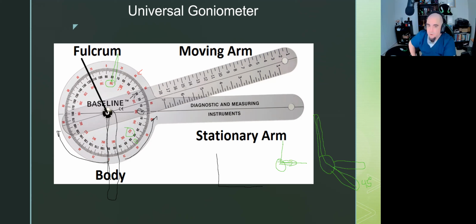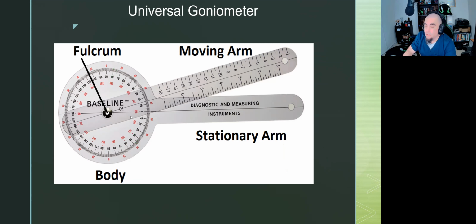And he's like, oh, he's got 280. Well, that's where Josh uses a little bit of his brain and goes, that doesn't make sense because my visual estimate was about 80 degrees. Oh, well, duh, I'm reading the wrong number. So that's where visual estimates come in handy, is making sure that you don't read the wrong number on your goni. And it's okay.